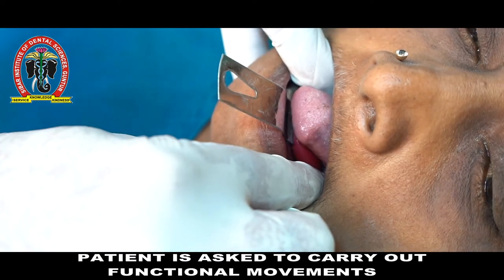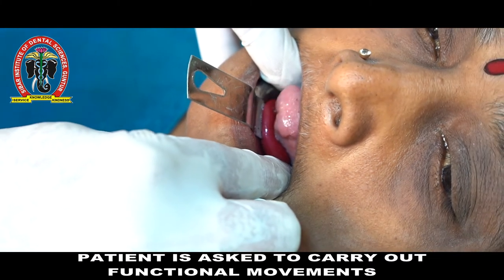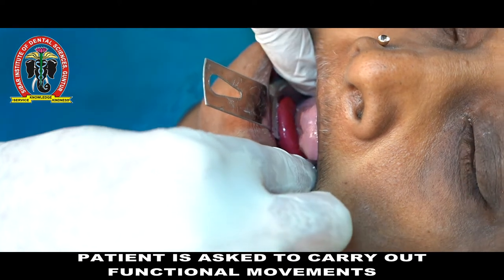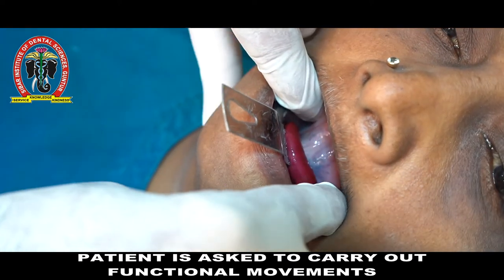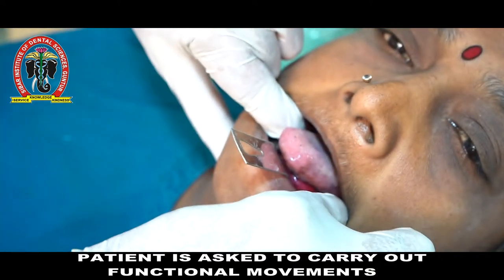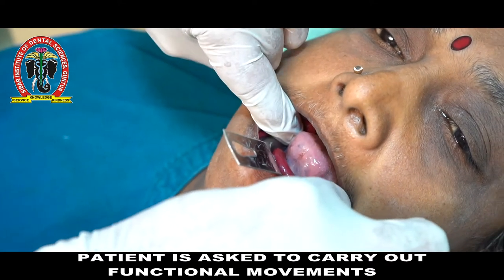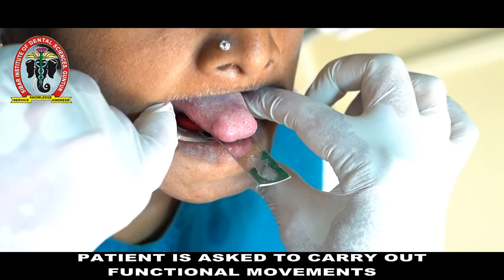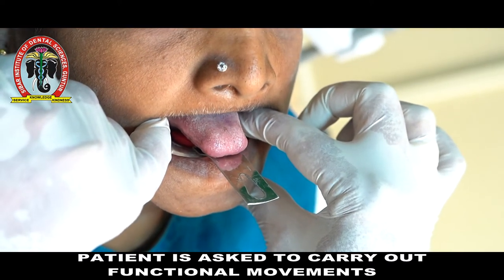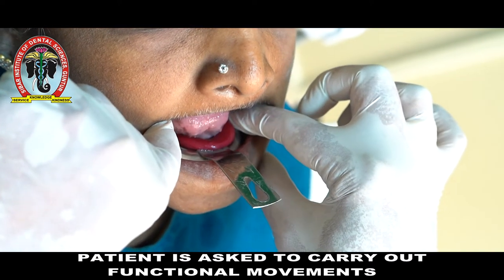To record the lingual vestibular areas, ask the patient to perform tongue movements. Protrusion of the tongue and left and right lateral movements of the tongue are necessary to record the lingual vestibular areas.